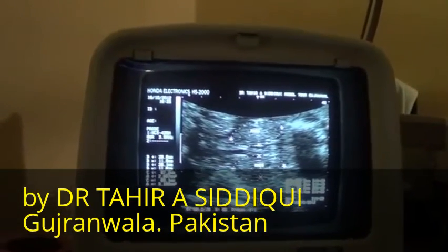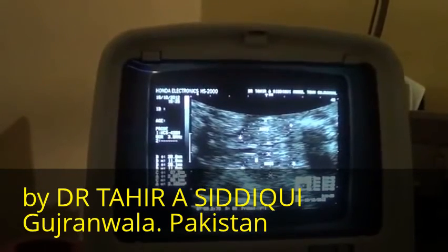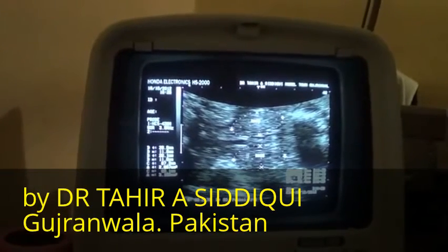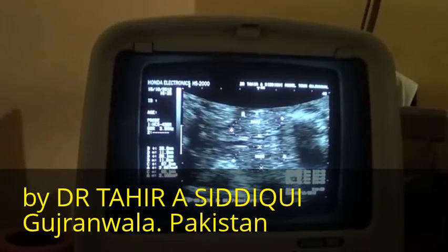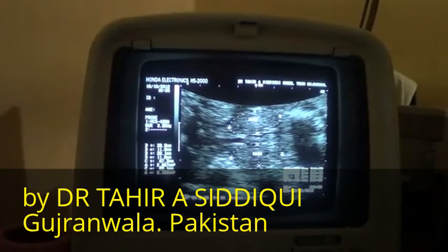So the dimensions of both masses are the same. They are well demarcated, they are evenly echogenic. There is no calcification seen within this and this mass.